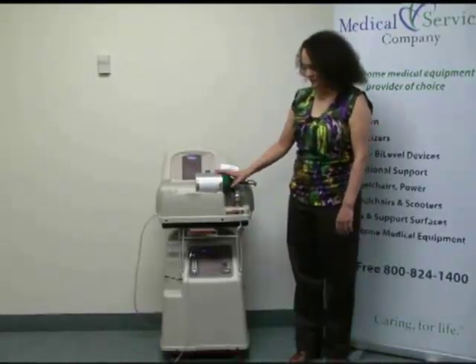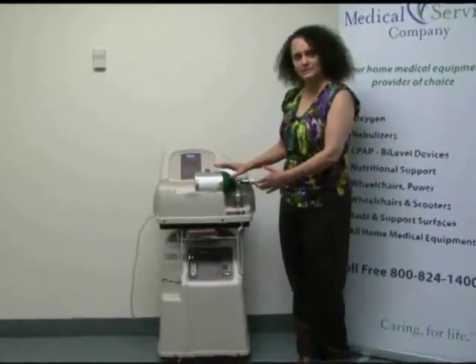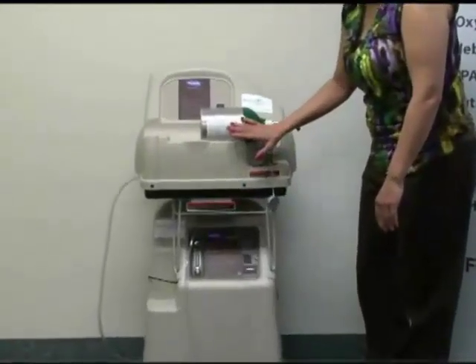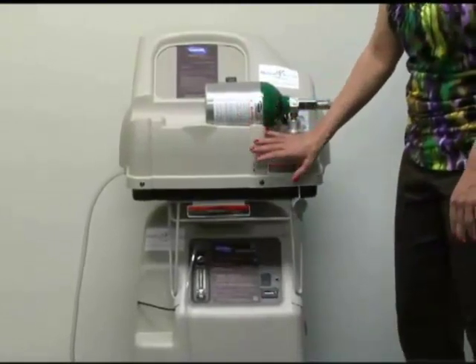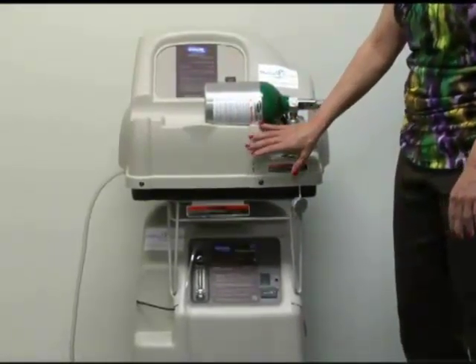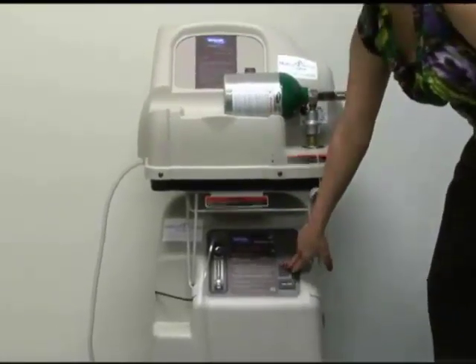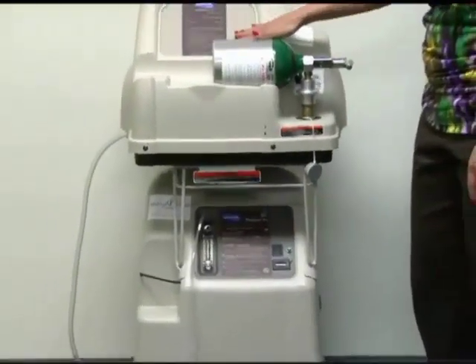Once you've got this system delivered, the drivers will bring it in and set it up. It should look like this: you've got your concentrator on the bottom and the home fill system on the top. It's very important to make sure that you turn both units on before you go to use this system, and it should be running for at least 15 minutes. Down on the bottom you would flip this switch on, and up here you would flip this switch on.